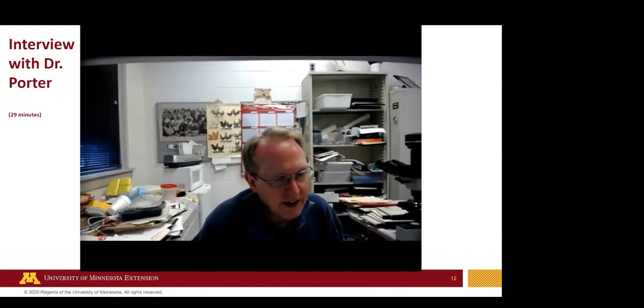Okay. So when we receive your bird at the lab, we enjoy getting a history. In other words, many people think this bird was poisoned, or it has this disease, it has that disease. That's because many of our clients now have books, they get on the web, they talk to neighbors, so they're convinced it may have a certain thing. Sometimes you're right, and sometimes you're wrong. So what I'm trying to say is I listen to your history, but I look for everything. Every diagnostic lab does that.